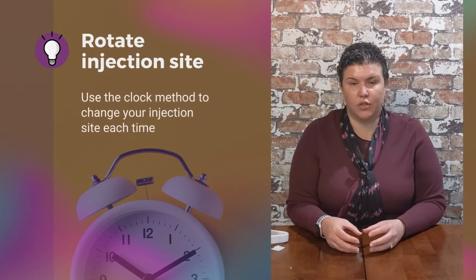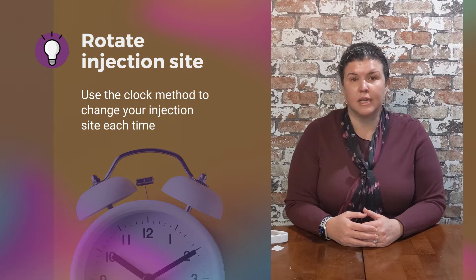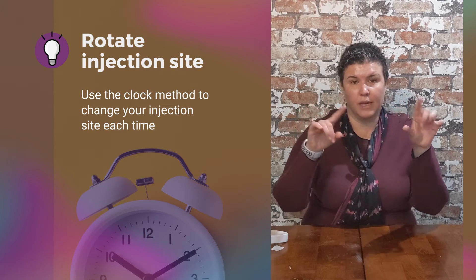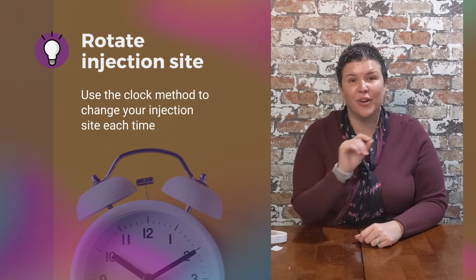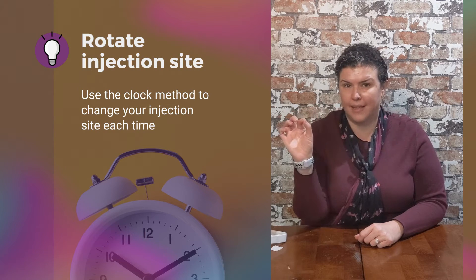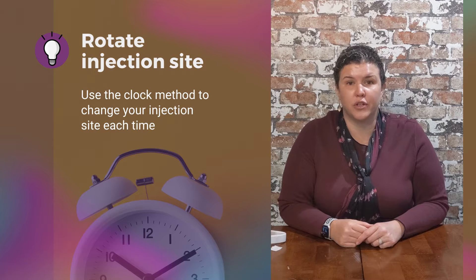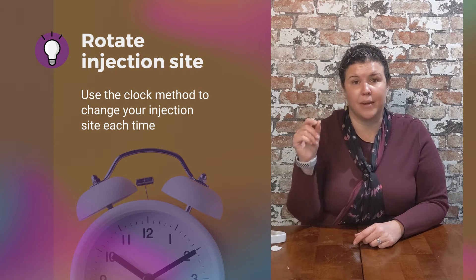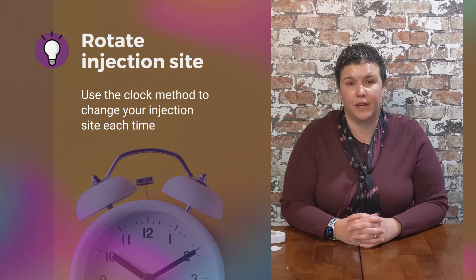You always want to rotate your injection sites. I tell my patients to think of each side of their abdomen as a clock. After each injection, whether day to day or week to week, you go from side to side. When you go back to that side, you pick a different number on the clock. This ensures that you never inject at the same point every single time and create scar tissue underneath that injection site.